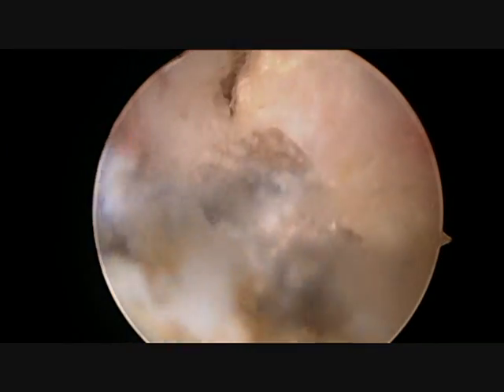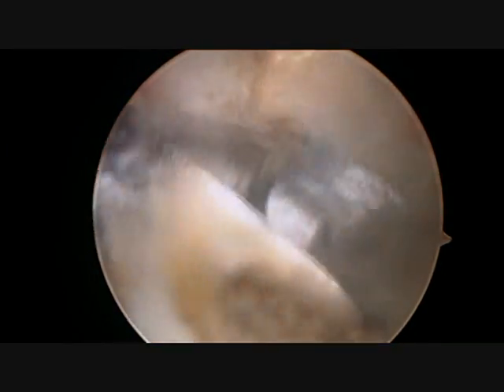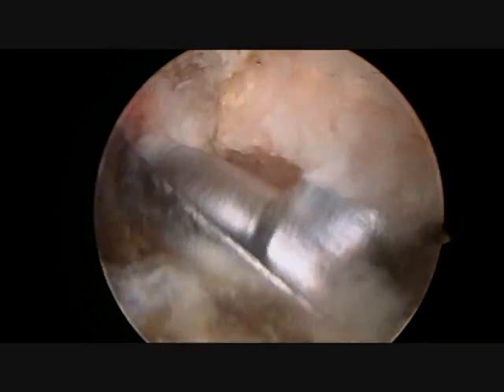Once this is completed, a small 4mm burr is inserted through the portal in front of the shoulder to remove the bone spurs from the clavicle.